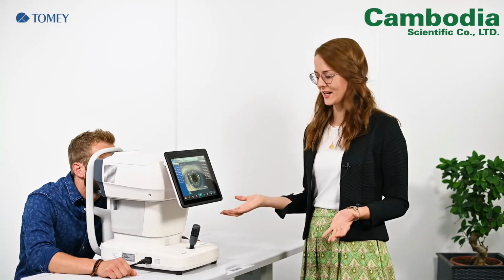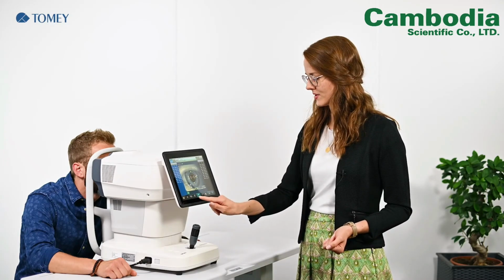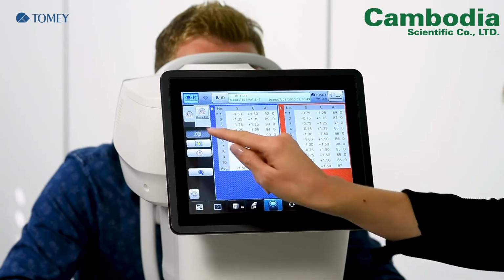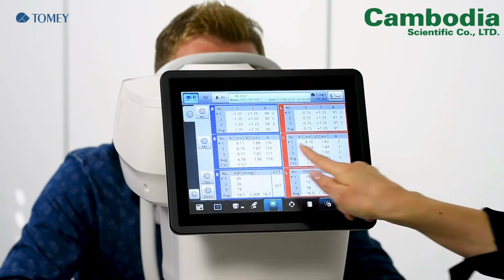Okay, so all measurements are done. We can go into the analysis. Therefore, just type here on the analyzing button. I show you now the normal refraction values and also the keratometer values.